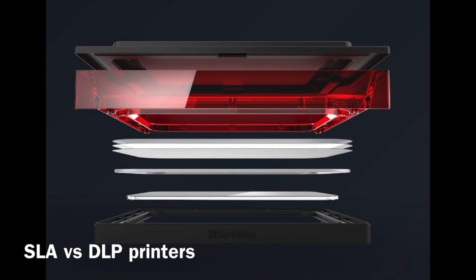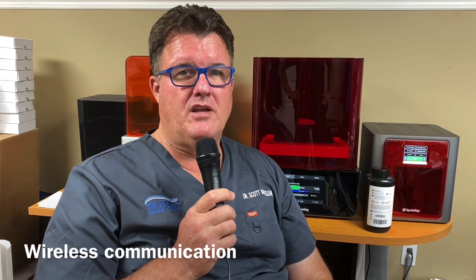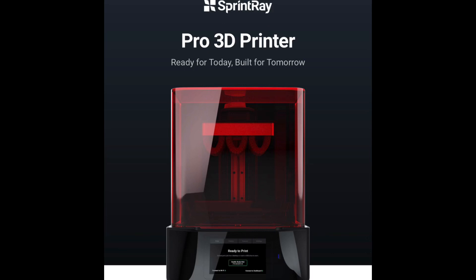When it's printing it's fairly quiet, and it's all wireless. You're on your computer, you design something and push a button to send it to the printer, just like printing a document on your printer at home. Once the product comes out we're going to talk about how this all works to make this easy in your life. Let's check out this Sprintray and see what's happening with it.